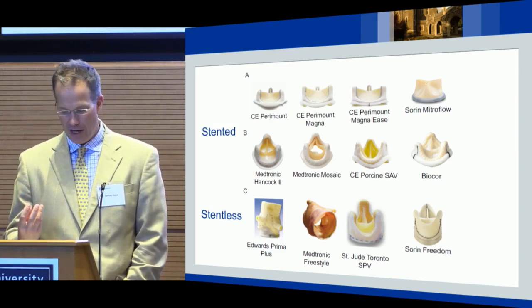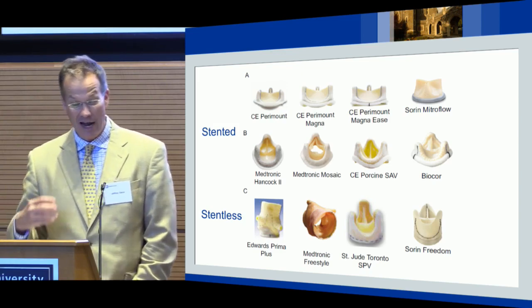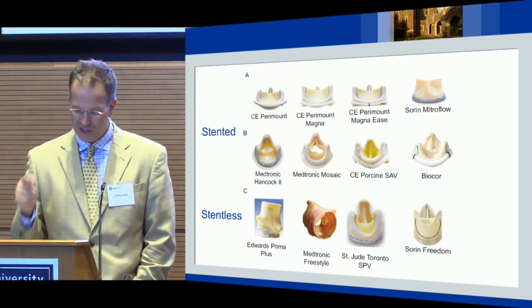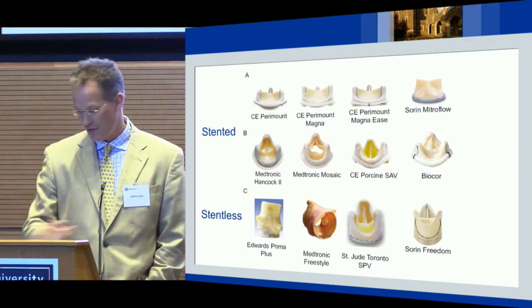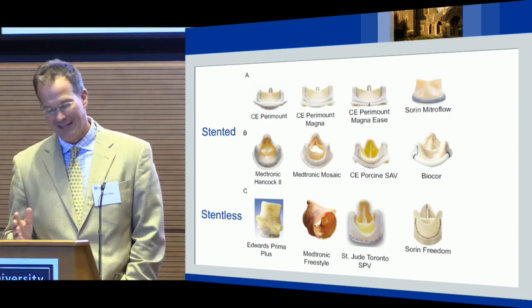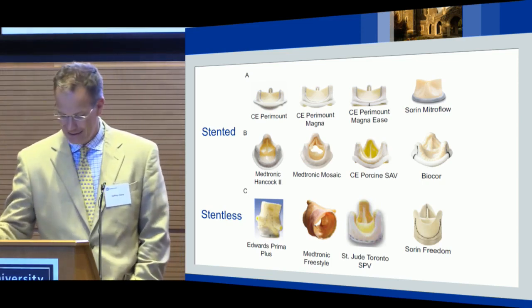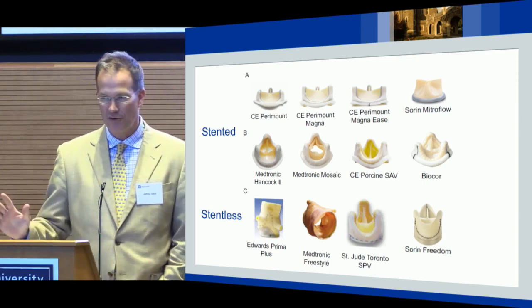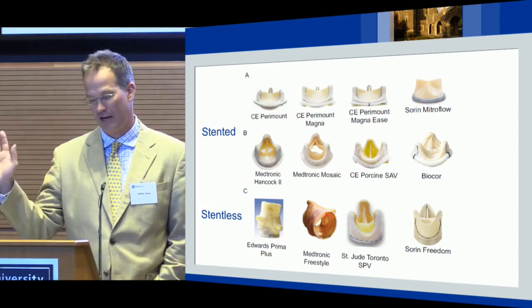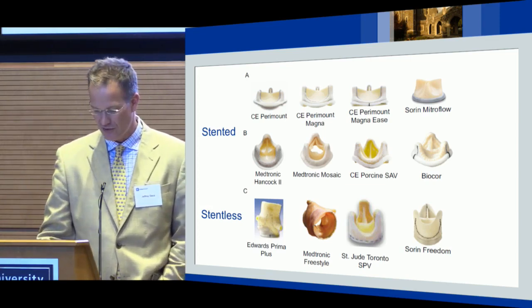That rigid stent is what's going to hold that TAVR device and limit the size of the TAVR device you can get in. Now, it's important to note here that every single one of these valves was designed before TAVR was even thought of, okay? I know that today they're trying to design surgical aortic valves with valve-in-valve TAVR in mind. But none of these, we're retrofitting this technology. When they were designing these valves, no one thought of TAVR. That was not going to happen. So you have to know your kinds of valves. And there are more valves than this, but this is pretty much what we use.